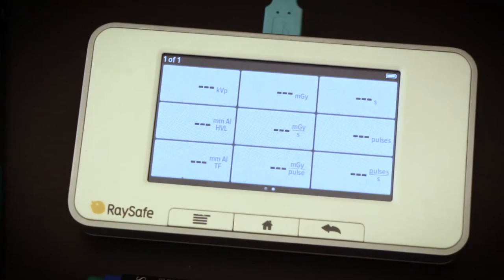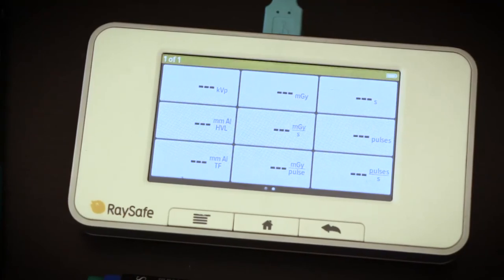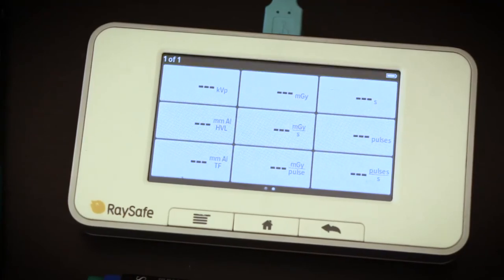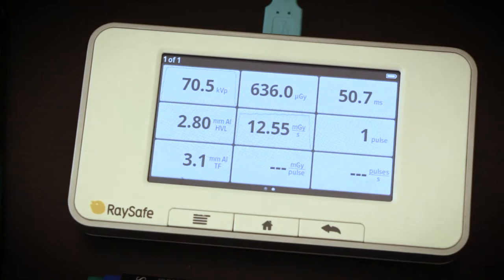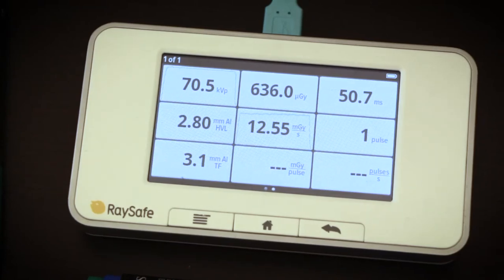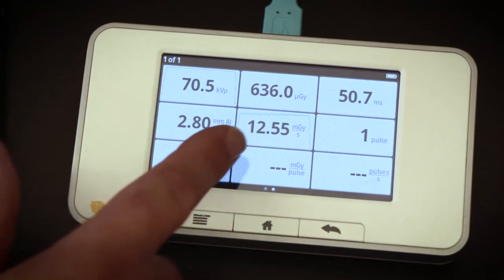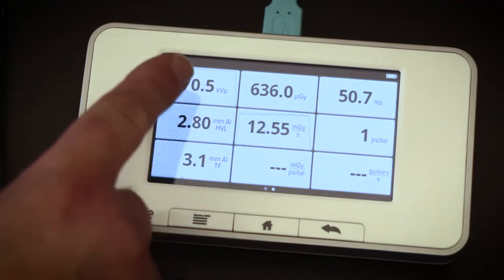Now I make an exposure. And without any settings, I get all parameters. Some of these also have waveform.